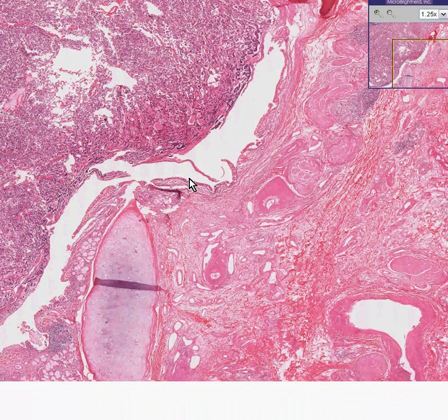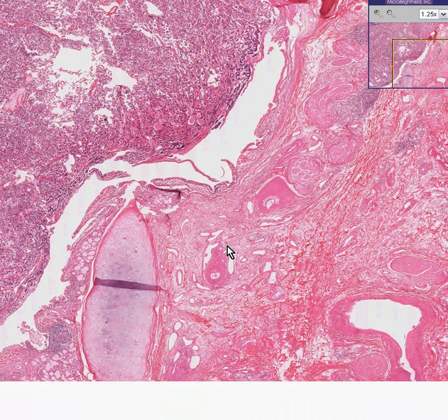This is a bronchial carcinoid. It is a neuroendocrine tumor, and it can be malignant. Most people would prefer to just call this a carcinoid and not use the adjective benign or malignant in front of it, because you never really know how it's going to behave. You can be better off just calling it a carcinoid, realizing it could be malignant, and describing its features and making your value judgment from there.